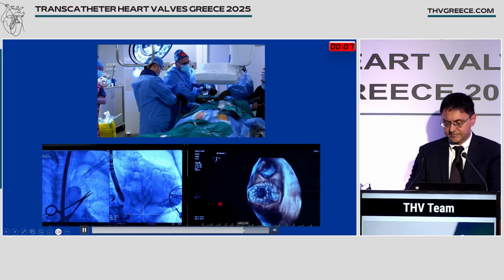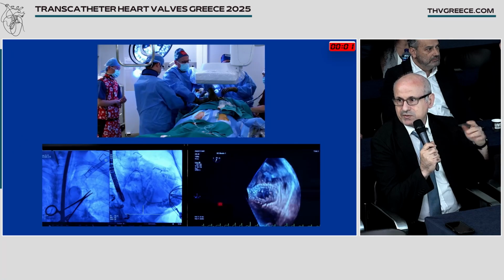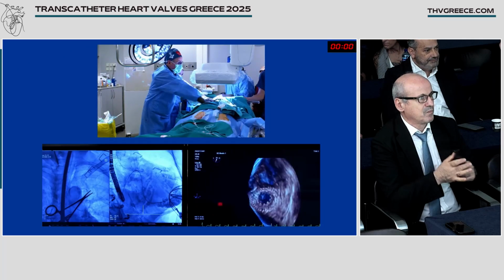And here we used, if I remember well, 2 proglides. That's correct. So it's not surgical cut down, it's with puncture of the jugular, echo guided, and 2 proglides at the beginning.